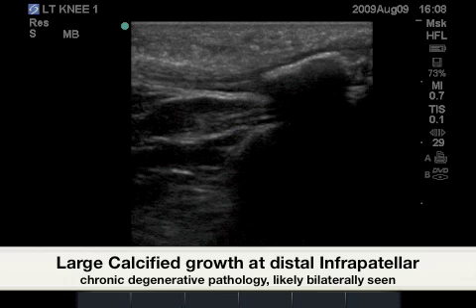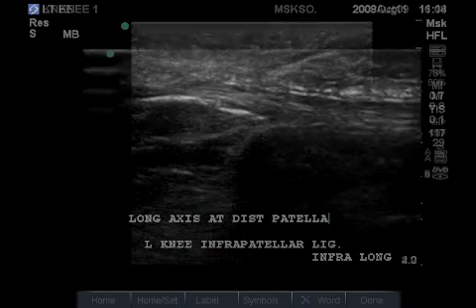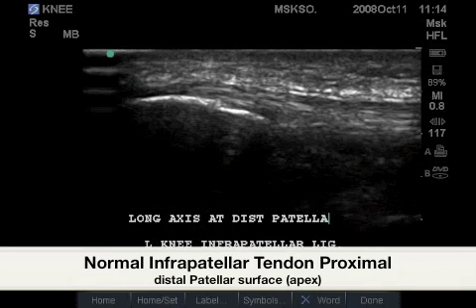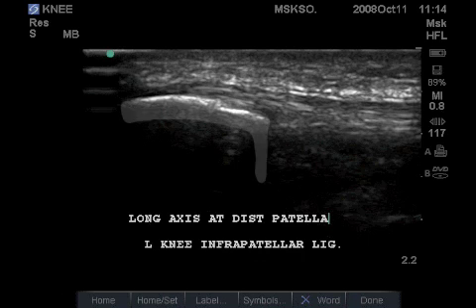In this image, we see a larger single calcific body at the insertion of the infrapatellar tendon. The next image shows the proximal infrapatellar tendon at the apex of the patella.